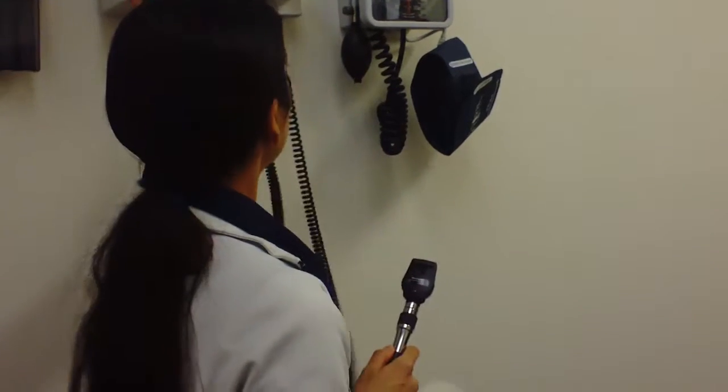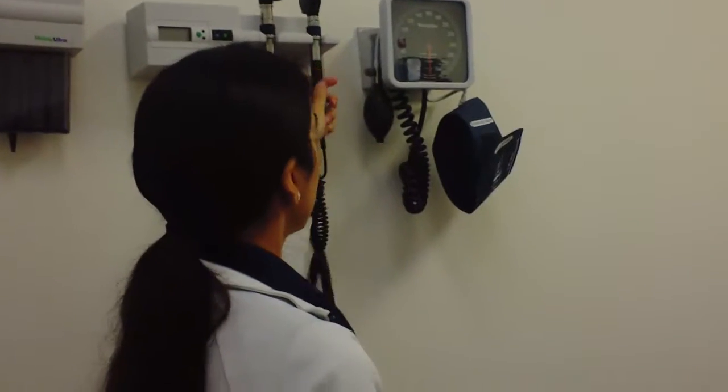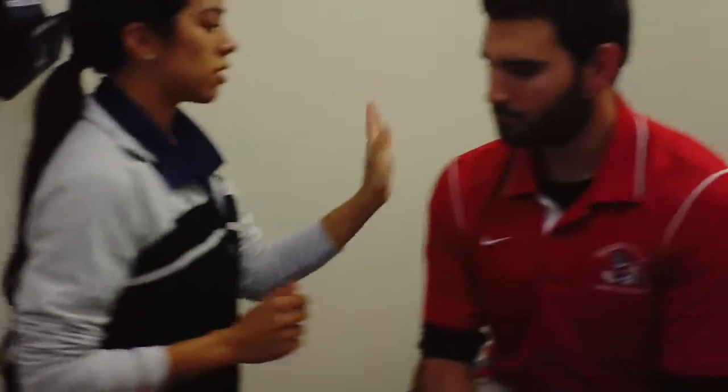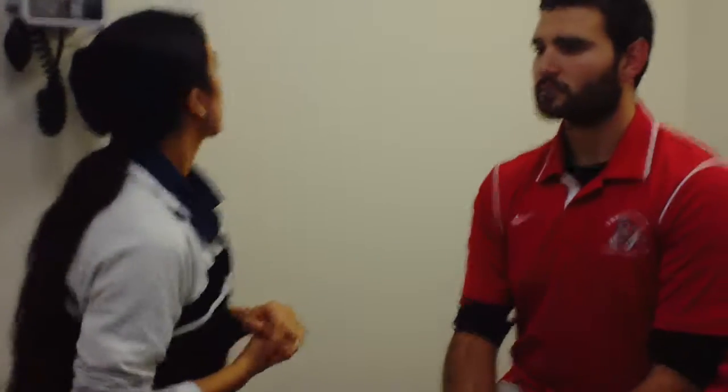So once I have those numbers figured out, I am going to have my patient appropriately sit, and then I'm going to adjust myself as well. So Jimmy, what I'm going to have you do is just go ahead and sit upright, and I want you to sort of stare into something so that when I examine your cornea and your iris and your retina, your eyes are not wandering. Okay, so what I want to make sure that I do now is that I let the patient know that I'm going to be real close.